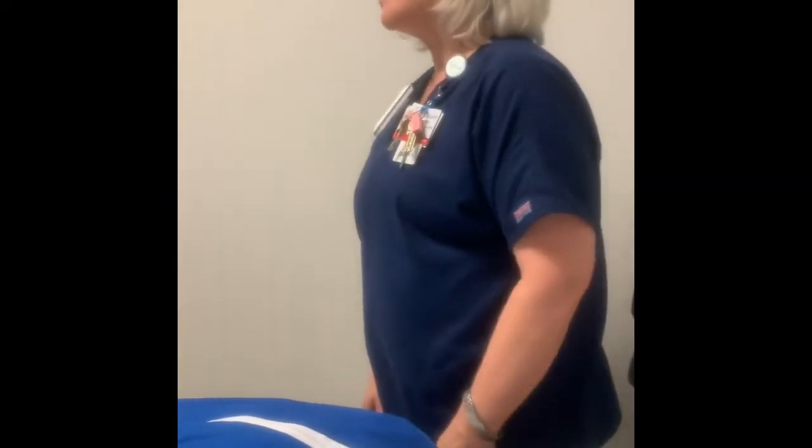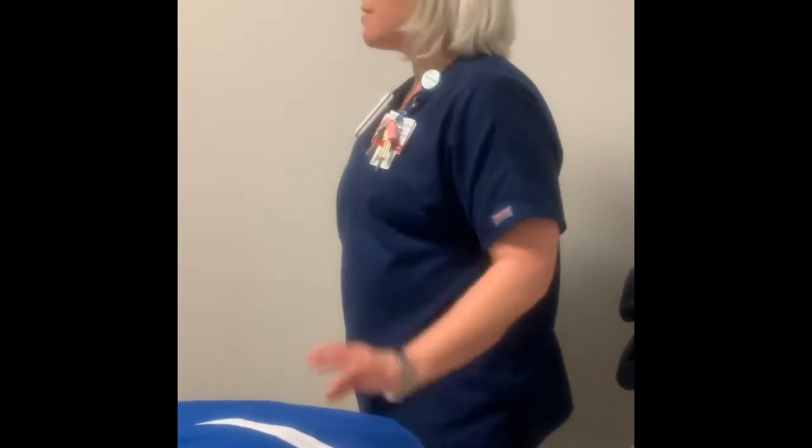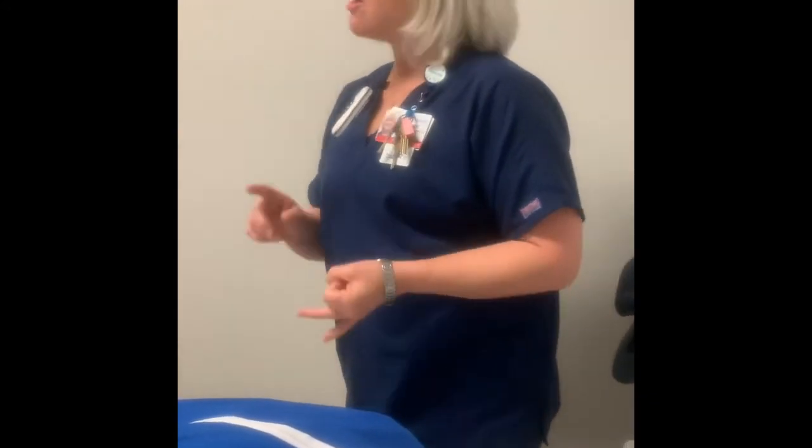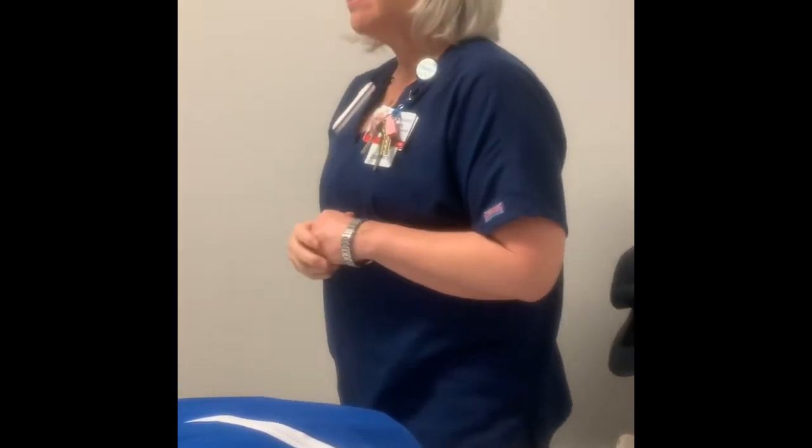Now, if you're out in the field, obviously you're not gonna run around with an ambu bag and everything else. But in here, you should always know. There's no reason you should never know what type of airway you're dealing with. Read the chart, ask the family, or talk to the physician, okay?